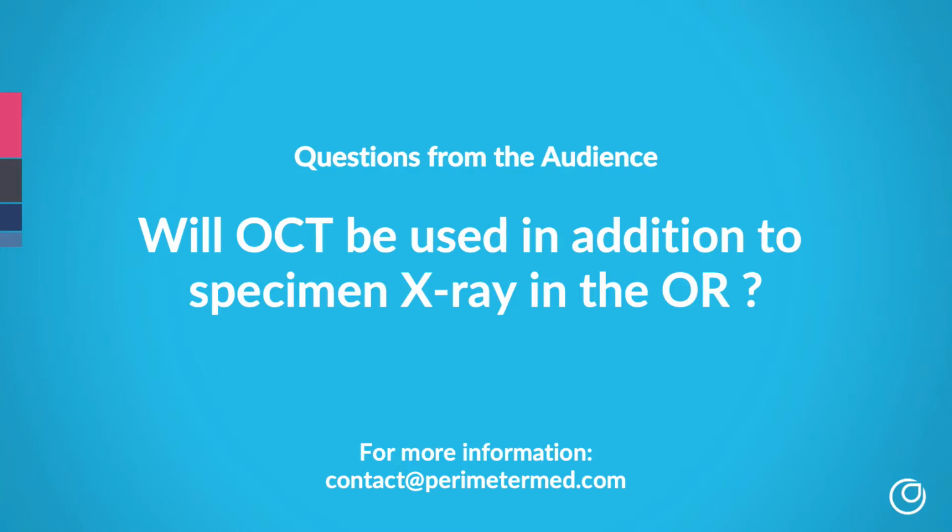I completely agree with that. Today, I had a case of pure DCIS where my radiographic clip was close to my inferior margin, as were the calcifications. So even before I imaged, I knew that even if I didn't have OCT in the operating room, I was taking an additional shave margin, which I did. It was negative, so I didn't even image that margin until after I had done the shave, because I knew that my marker was way too close to the margin, as well as the calcification.